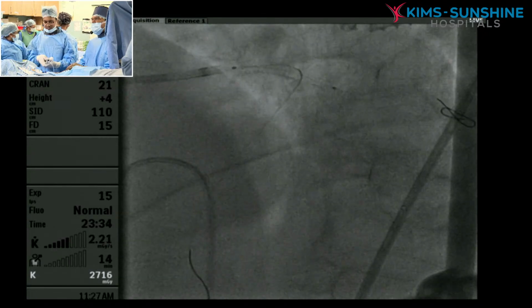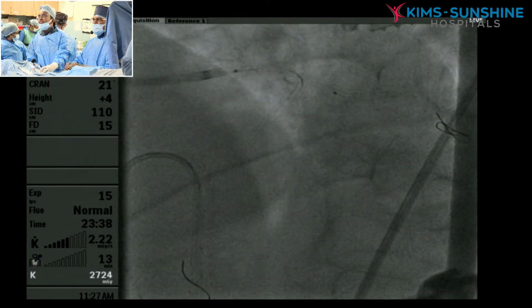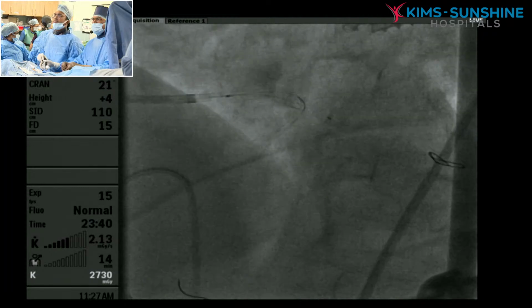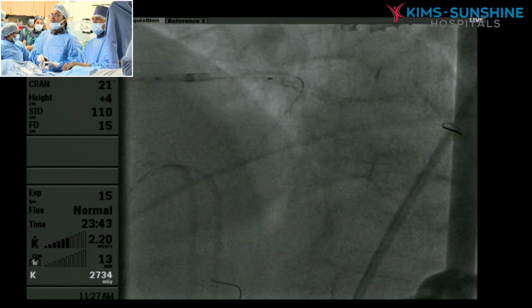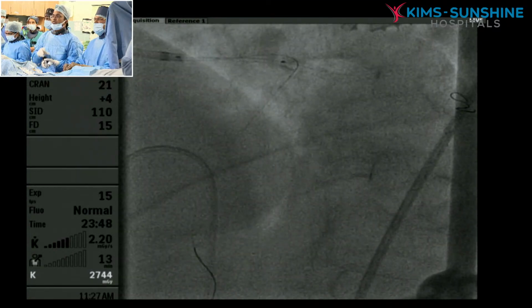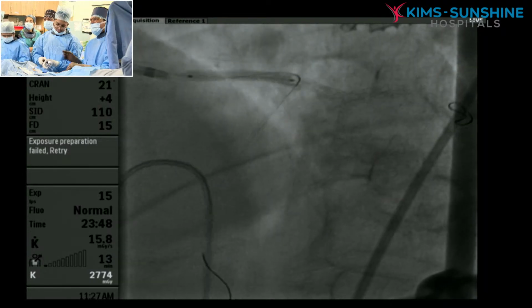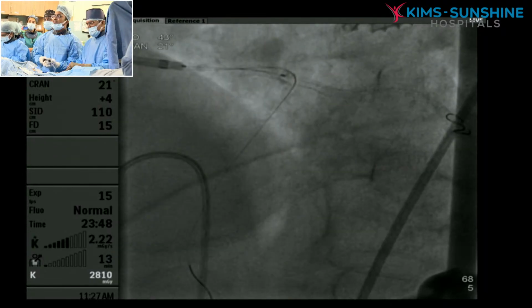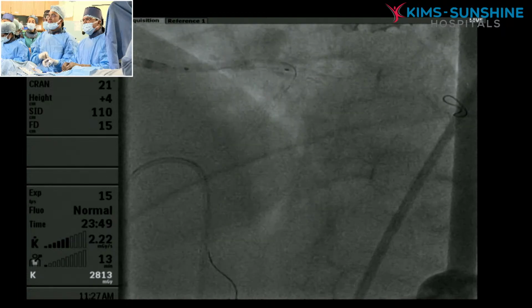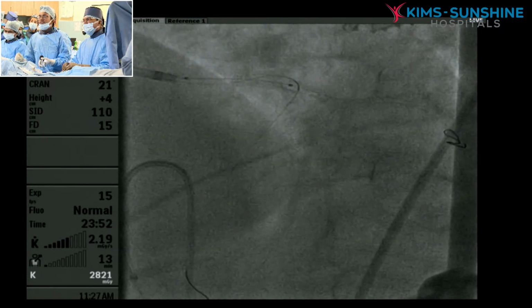Whether you give 8 or 12, it's fine. I did not give 8. I will pull slightly. Okay, one minute. Do it now. Do it. Go, 18. Deflate. Deflated.